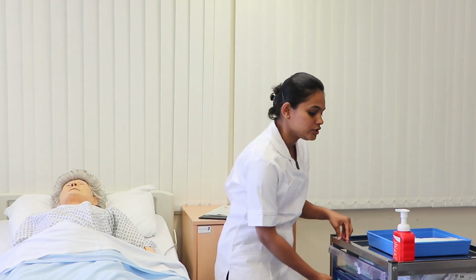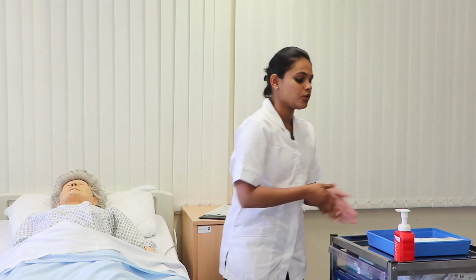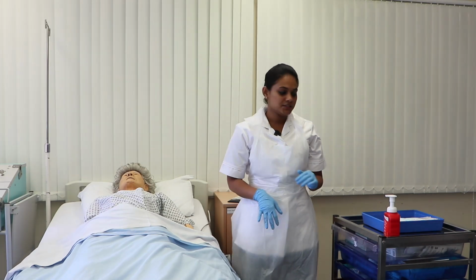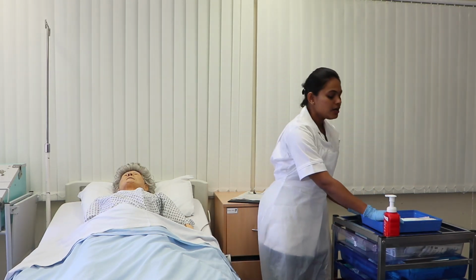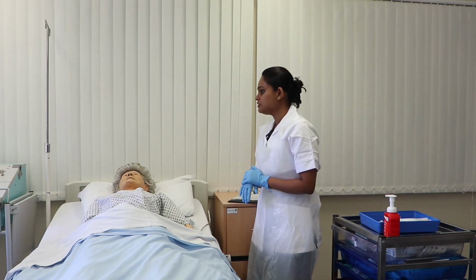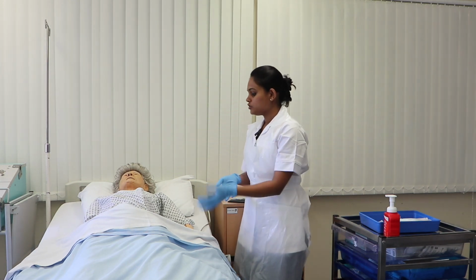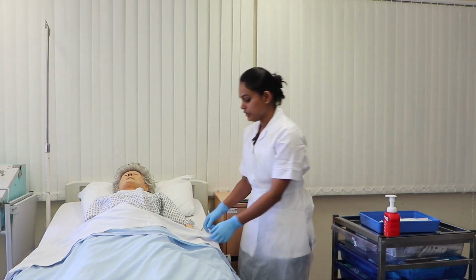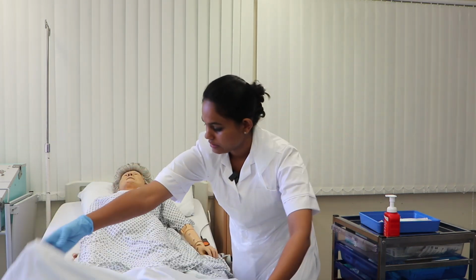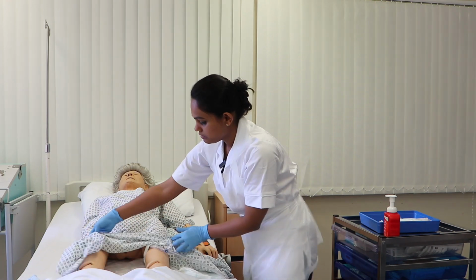And now I am going to wear my apron and gloves, a quick hand rub. Now I am going to approach my patient by minimally disturbing the curtains. Okay, Grace, I am back with the equipment. Are you still happy for me to continue the procedure? Yeah. Okay, and now I am going to expose your genitalia. Is it okay for you? Yeah. Roll down the blanket and rolling up the gown.